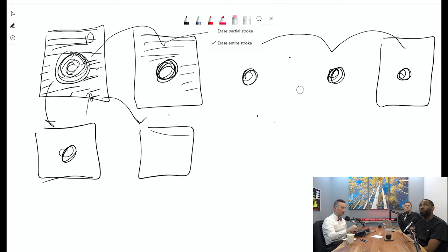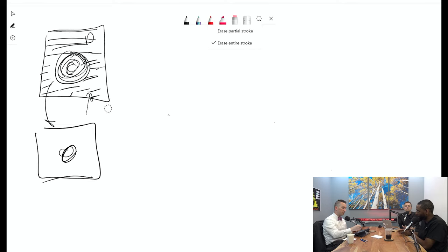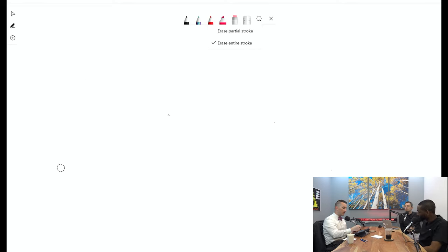Real quick, when you started talking about how many slices you can get, or how many seconds between each slice, that's what they're talking about with temporal resolution, right? Temporal resolution can be different things inside of cardiac, but in terms of the angio sequence, it's the time between one phase and the next phase. In these twist sequences, you're getting a 3D every 6 seconds. You want a high temporal resolution, as many phases as possible, because you want to see the contrast flow in. That's an awesome question. You have to consider the flow rate of what you are imaging.